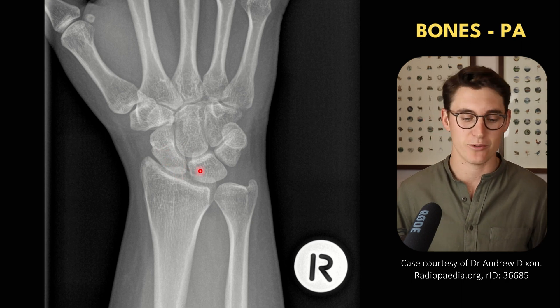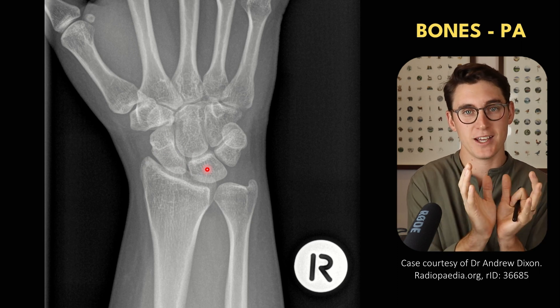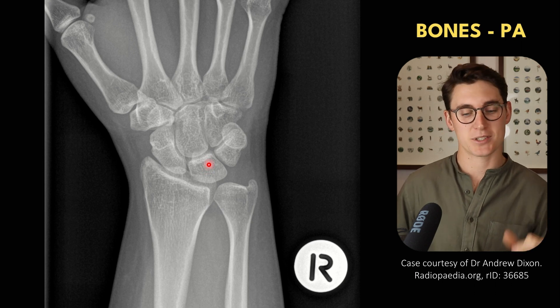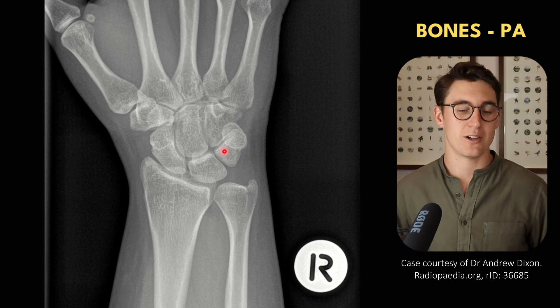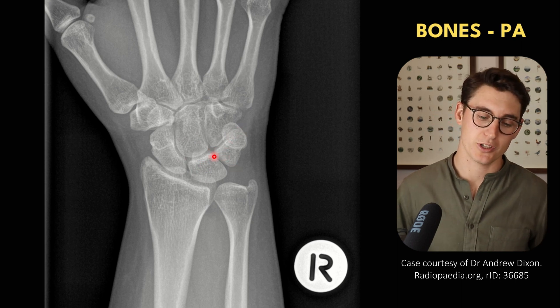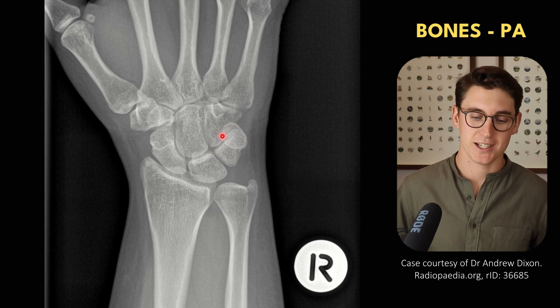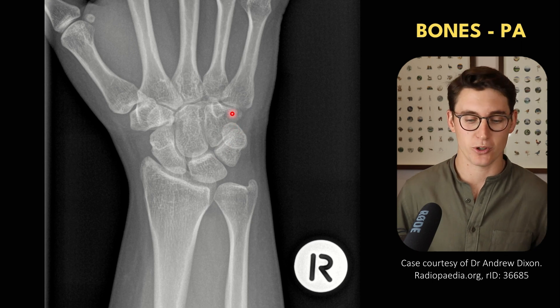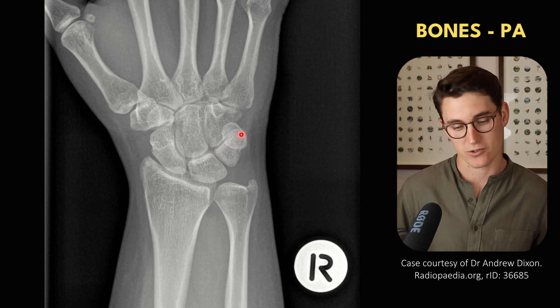Medial to our scaphoid is our lunate bone — lunate meaning moon shaped. On the lateral view, the lunate bone is crescent shaped and it actually cups the capitate above it. Then more medial to our lunate is our triquetrum, our three-cornered bone with its triangular shape. Just anterior to that triquetrum is our pisiform, which means P-shaped. It's technically a sesamoid bone lying within our flexor carpi ulnaris tendon, anterior to the triquetrum.